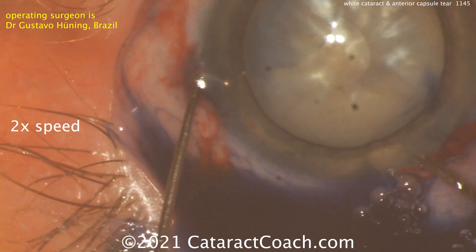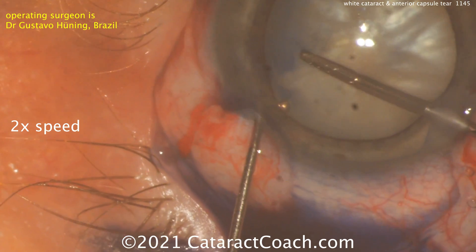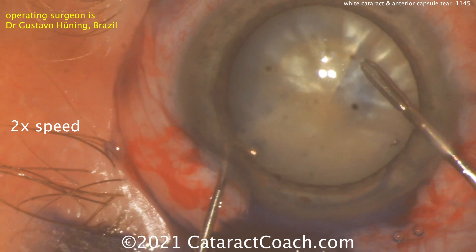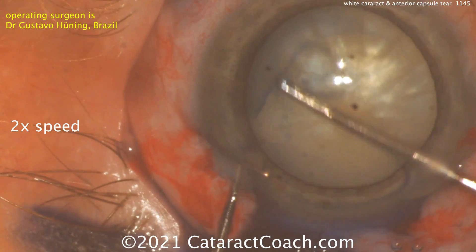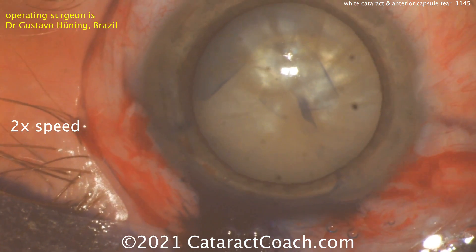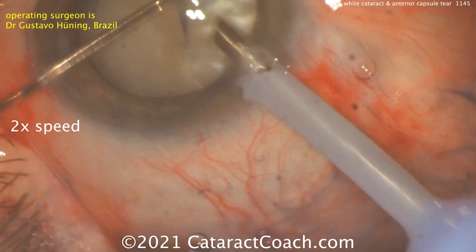Starting off with capsule forceps, fixating the eye with the chopper, capsule forceps go in for the rhexis — and immediately it runs right out. There's an anterior capsule tear that ran out towards the zonules. You can see it right where the chopper is holding the eye. The rest of the rhexis can be completed, but how do you finish this case? That's an area of weakness — you don't want it to zip around to the lens equator and then zip again to the posterior capsule. So how can you prevent that?